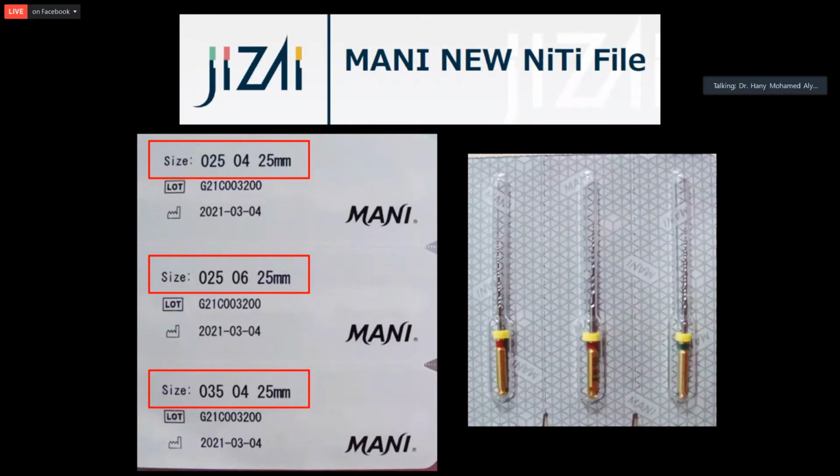That is 0.04 taper size 25, or size 25 taper 06, or 35 04, and then it also has the size 40 as well.